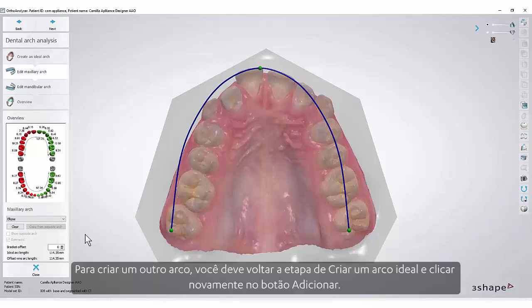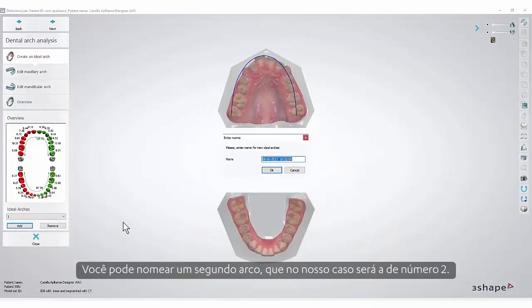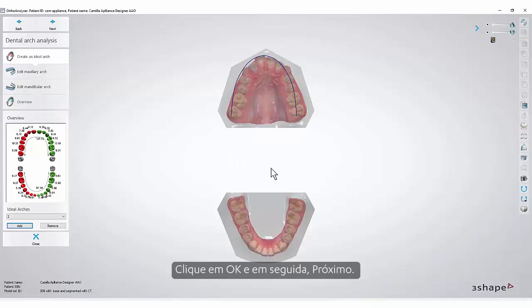To create another arch you must go back to the Create an Ideal Arch step and click the Add button again. You can name the second arch, which in our case will be number 2. Click OK and then Next.